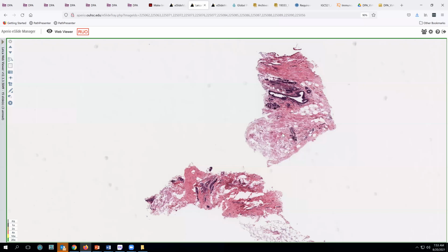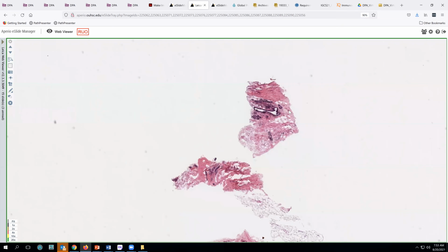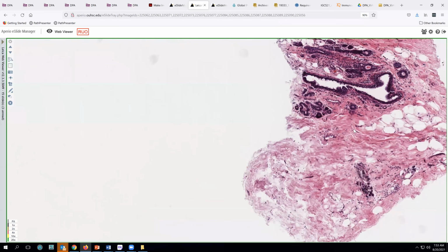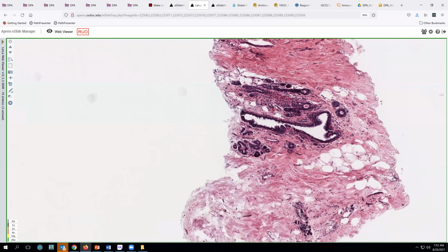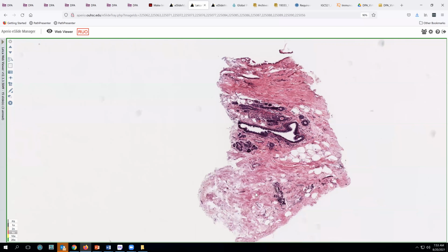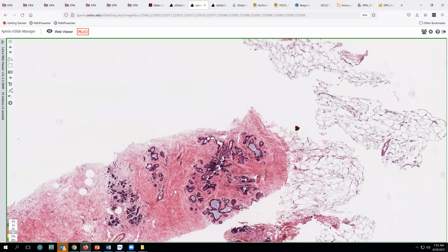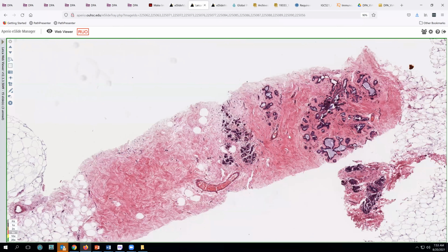Typically, many of these patients will be reviewed at tumor board, even in the benign circumstances, especially if there's any question of a discrepancy between the radiographic findings and what we've reported. We're not seeing really any degree of hyperplasia here. We're just seeing benign breast tissue with areas of stromal fibrosis. And if that fits with what he saw radiographically, then the patient's fine.